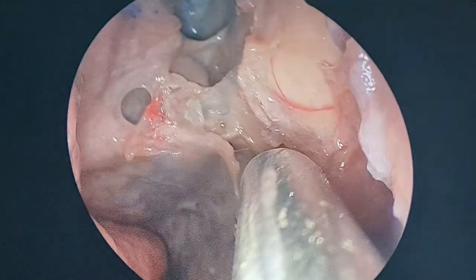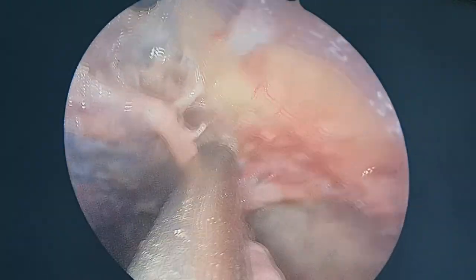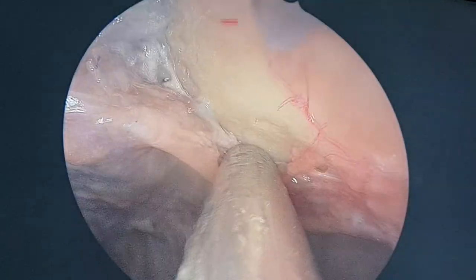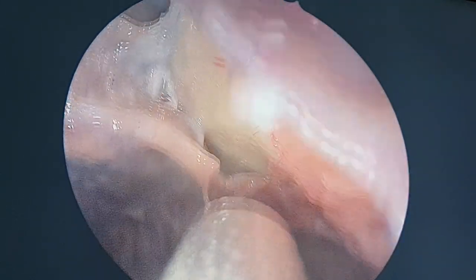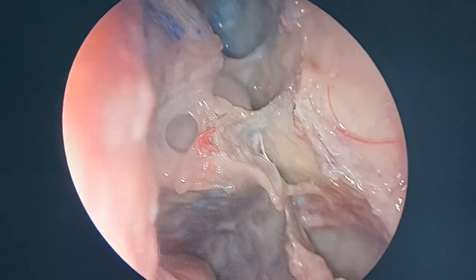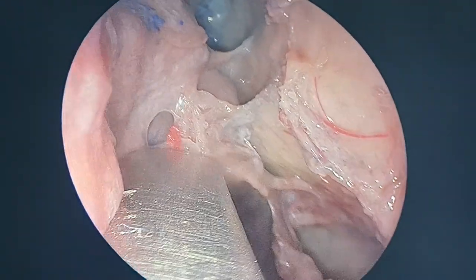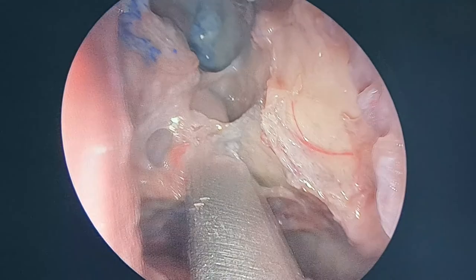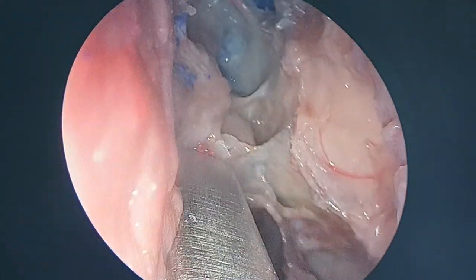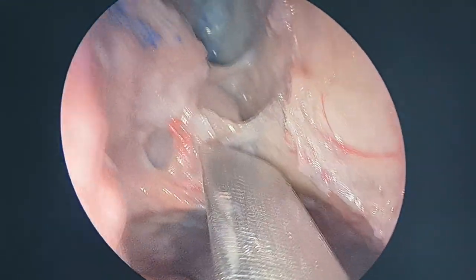See this. The landmark, which I always tell surgeons, is a life-saving landmark. See this. This is the orbital floor, the maxillary roof. This landmark, I call it the maxillary line, if you draw it horizontally. This is a life-saving landmark for many reasons. This is the maxillary line. So now, why is it important? Number one, we have to make the entry into the ground lamella to enter into the posterior ethmoid. Where to make the entry? At the level of the maxillary line.